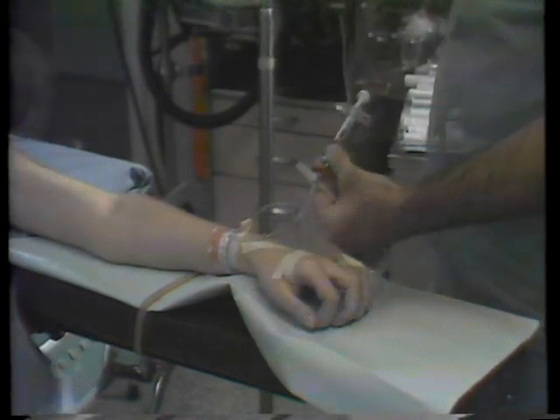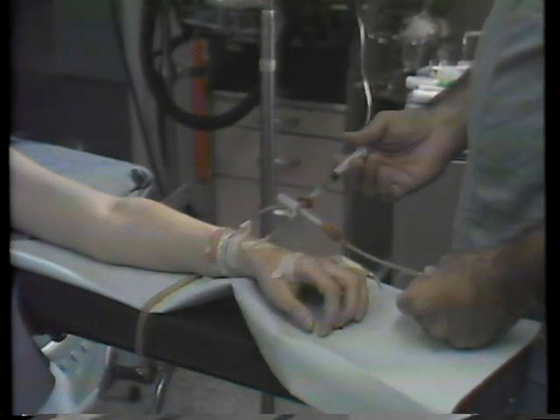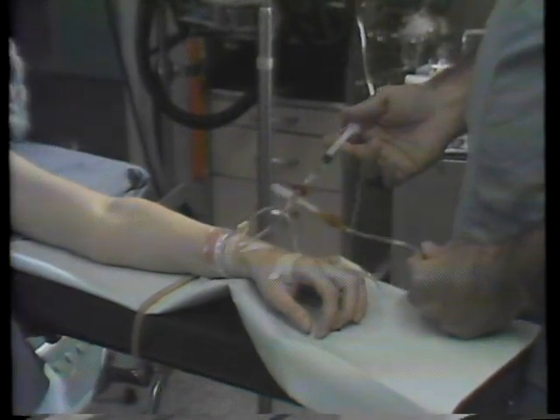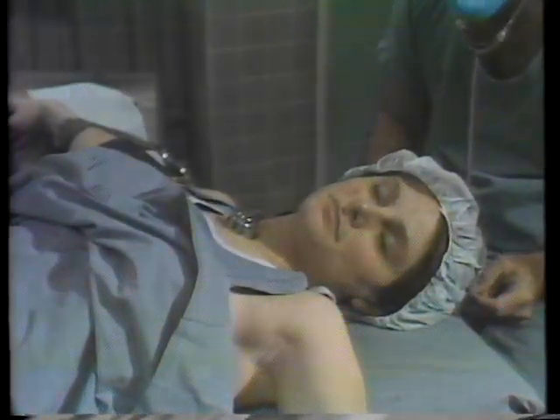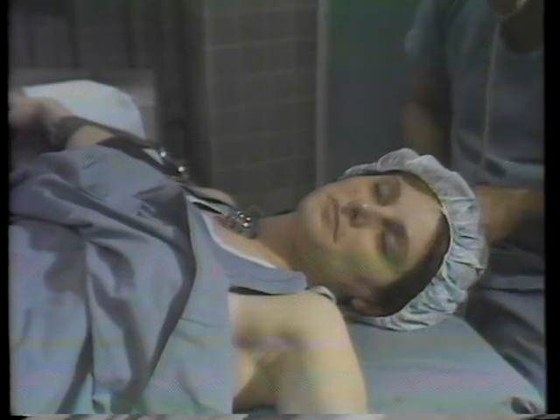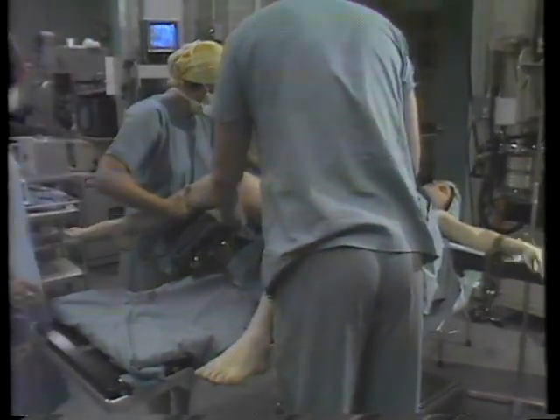You may then have various instruments placed to take your blood pressure and pulse. Your legs will be placed in stirrups.